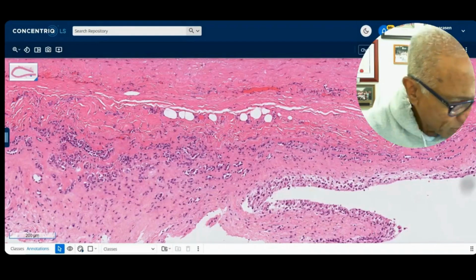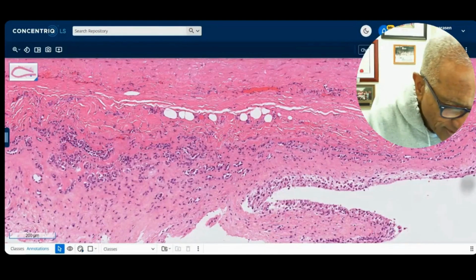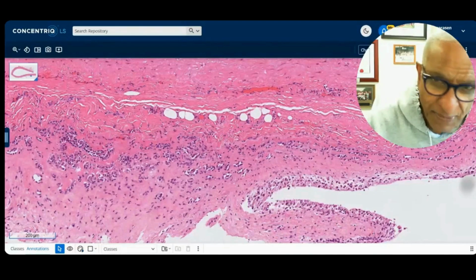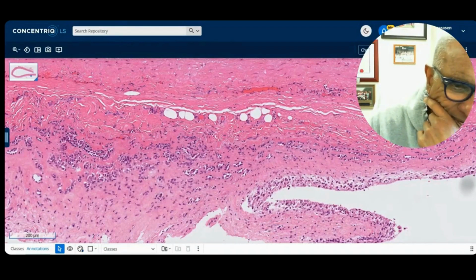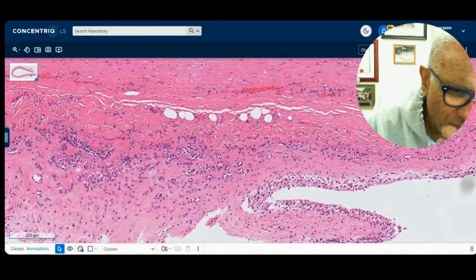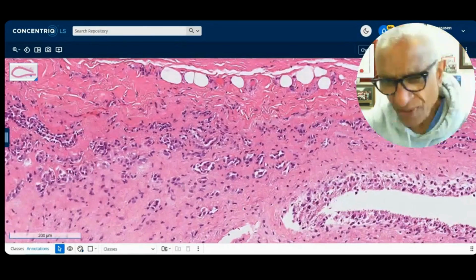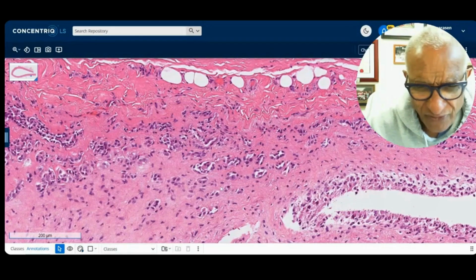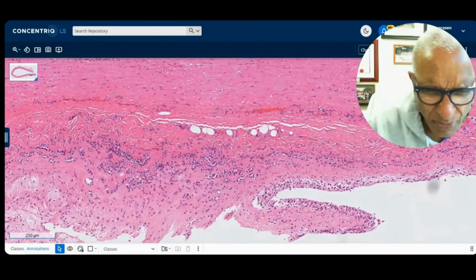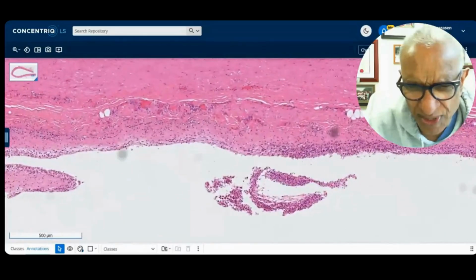Just a nice sort of odd lesion that we see, but even if you did the vascular markers, they'd be negative. And if you did the epithelial markers, only keratin was positive, but they look so bland. And just think of the adenomatoid tumor, uterus or paratesticular. It's a similar type of morphology, except the adenomatoid tumor is regarded as a neoplasm. These are not. These are just loosely aggregated in the serosa, and you can see that around heart valves with some fibrinous exudate. I saw one probably a few months ago, also from the cardiac team, which was a nice example of that.